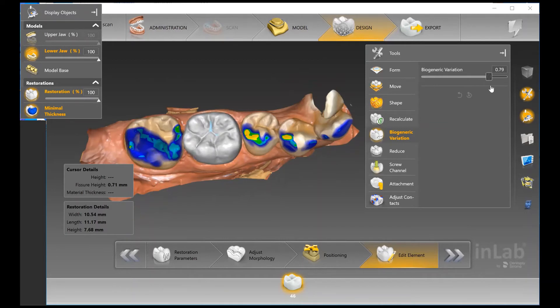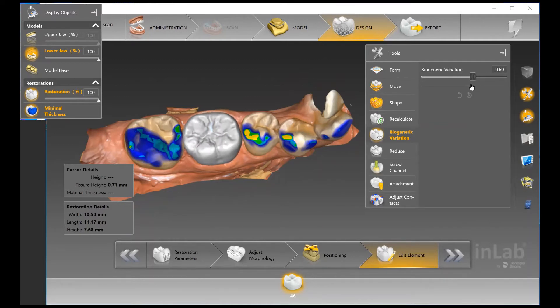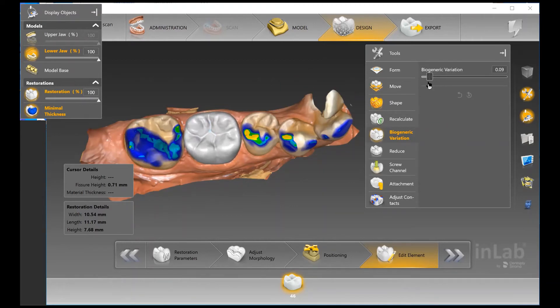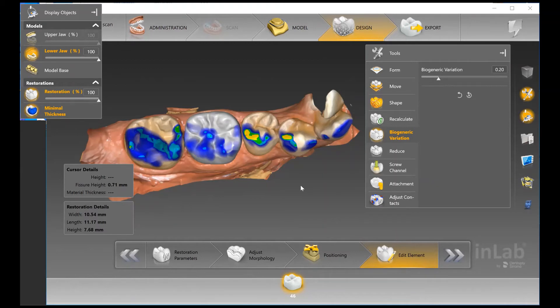You can scroll through different options where the tooth changes its morphology and anatomy on the occlusal surface, and it changes your contacts a little as well. I always recommend as step one: first determine if there's anything you want to change about the morphology, because you'd never want to get your contacts perfect and then use Biogeneric Variation — you could lose the contact detail you've already created.